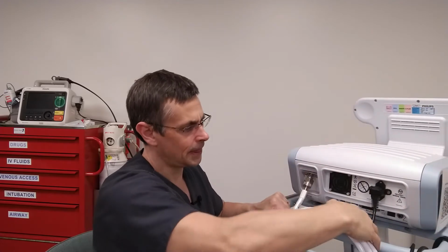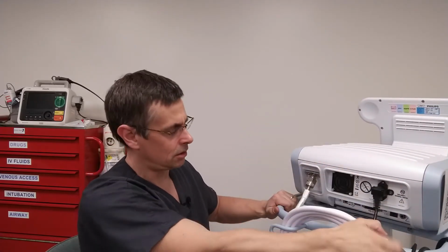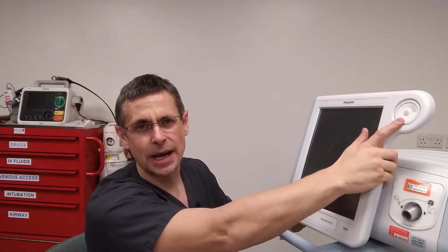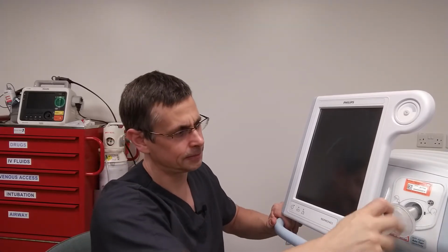Power cabling here, oxygen tubing here, goes in the main port in the wall. There is an oxygen cylinder on the base, but that's only for patient transfers. Patient circuit goes here, and pressure monitor tubing attaches here. The V60 is a touchscreen, but just in case you can't use it, there is a dial pad as a backup. The circuit that's used with the V60 isn't compatible with any other ventilators in the department. It comes with a bacterial filter in the packaging.